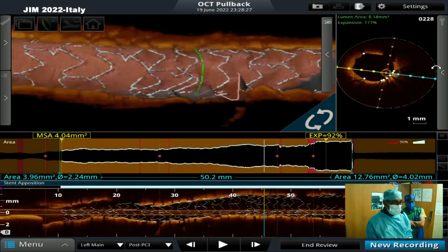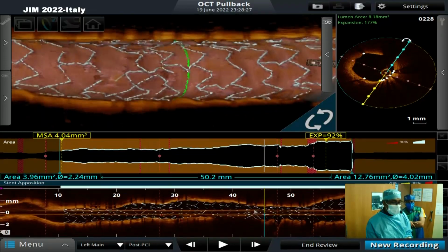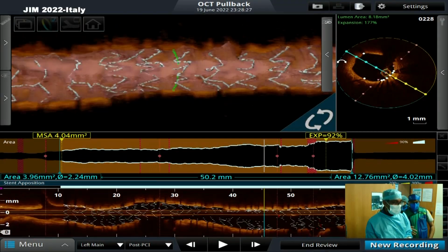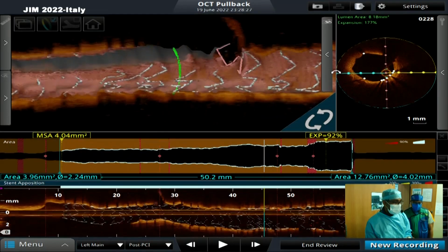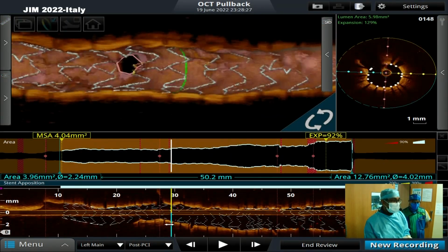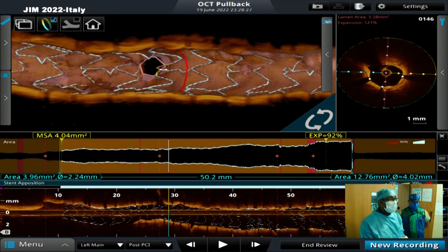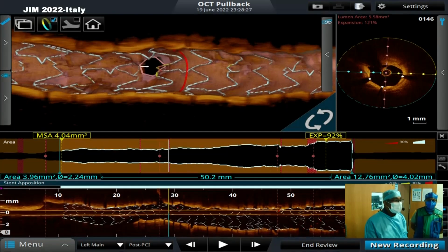I'm saying, you can leave it. Definitely, I think I will not do anything. But since we're doing precision PCI, you're going to do the OCT after we go off camera, and you're going to email me the result about the mid lesion and the ostium. Personally, I'm curious, but it doesn't have to be part of the live case. We can successfully complete it on time.